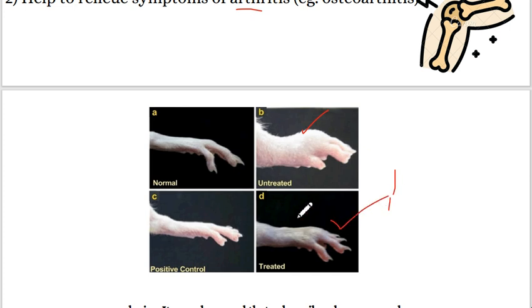Lastly, the conclusion was that it was observed that celecoxib reduces paw volume, and the paw volume of celecoxib treated rats was found to be less as compared to the vehicle treated group, and the average percentage inhibition was 40.92 percent, which we got as the anti-inflammatory activity of celecoxib.